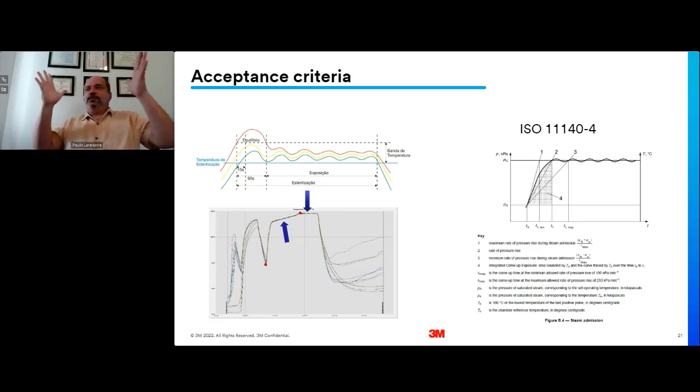So if you look into the sterilization process, we need 3 minutes at 275, right? If I have a come up curve of 13 minutes, there's no chemical indicator that is going to work in this sterilizer. Everything that you're going to read, no matter the manufacturer, no matter what type of indicator you're using, is always going to show an approved cycle because of the excessive temperature, excessive exposure, even though it is not the exposure phase per se, but it does have a lot of temperature during these 13 minutes.